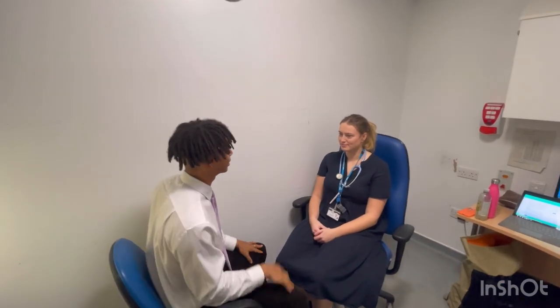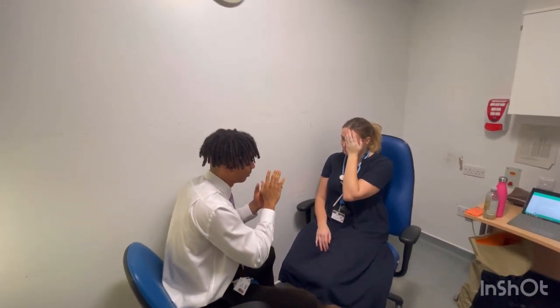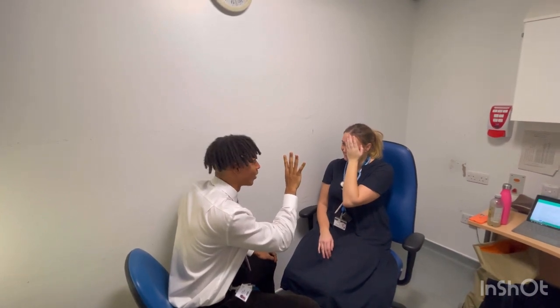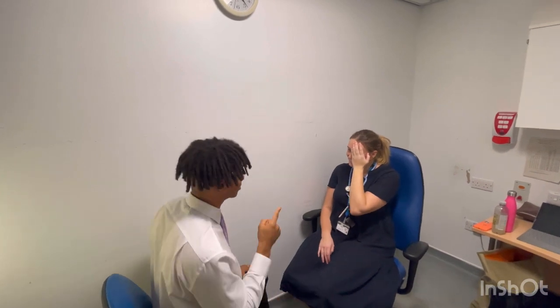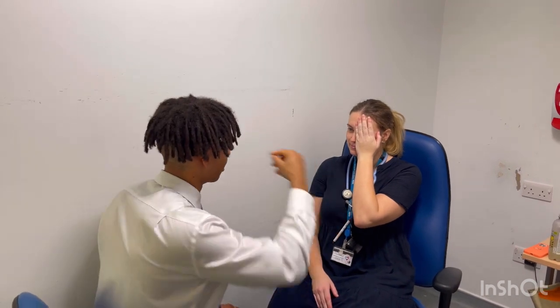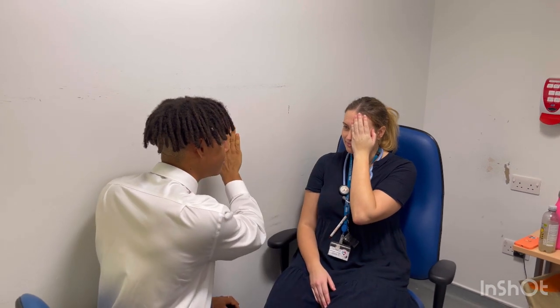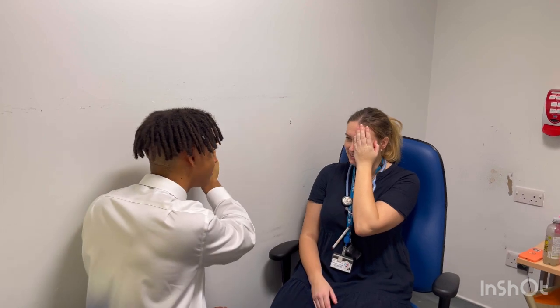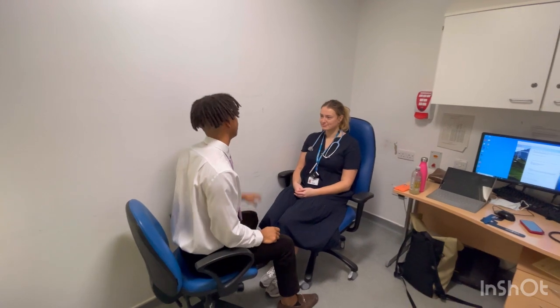Now, let's say you've got this far. If they can't read the top line, you get close and ask them how many fingers they can count on your hand. If they're able to count the fingers, you can document their visual acuity as counting fingers, which can be seen as CF. If they are unable to count fingers, you can get them to tell you which direction your hand is moving, up, down, left or right. So get close, move your hand in those directions and see if they're able to tell you which way your hand is moving. This can be documented as hand movements HM.